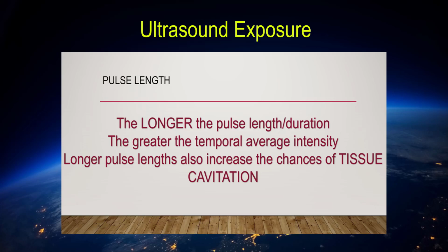Pulse length. The longer the pulse length, the longer the duration, the greater the temporal average intensity of ultrasound. Longer pulse length is also known to increase the chances of tissue cavitation.